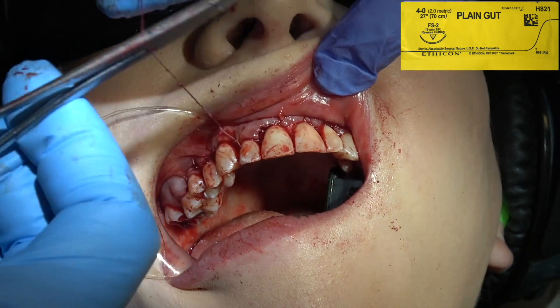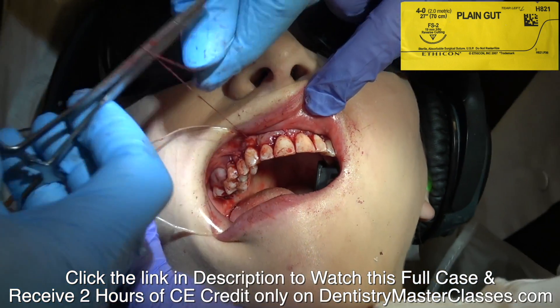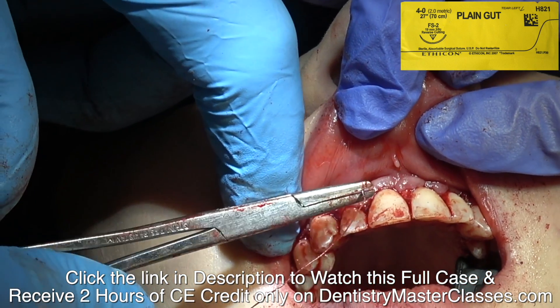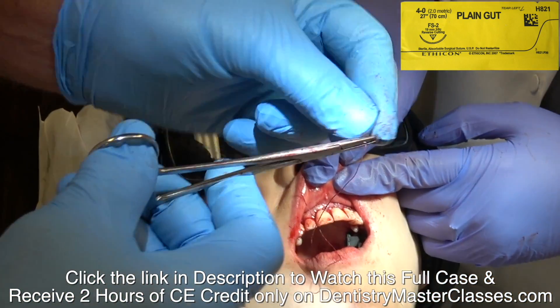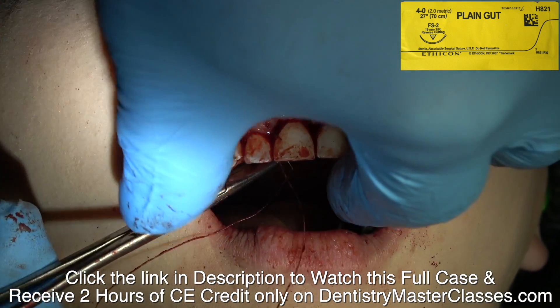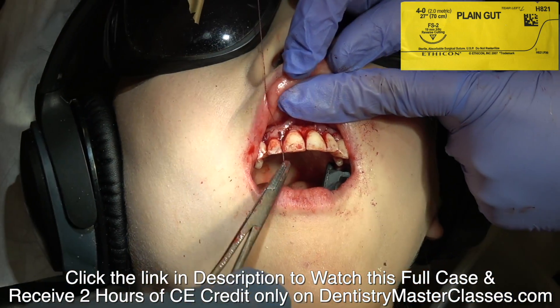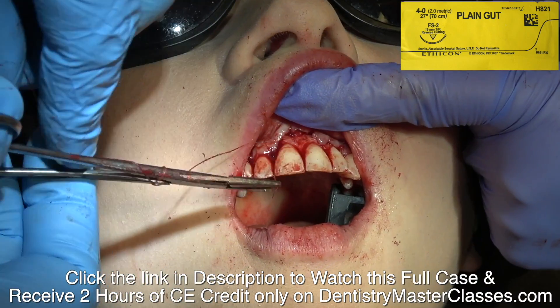You can see the new gingival line developing. You're exposing the entire coronal part of the tooth from the incisal edge to the CEJ, and then the alveolar crest should be about three-plus millimeters from the new gingival line to the alveolar crest.